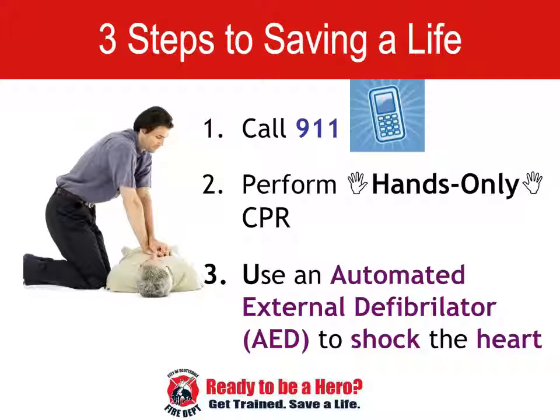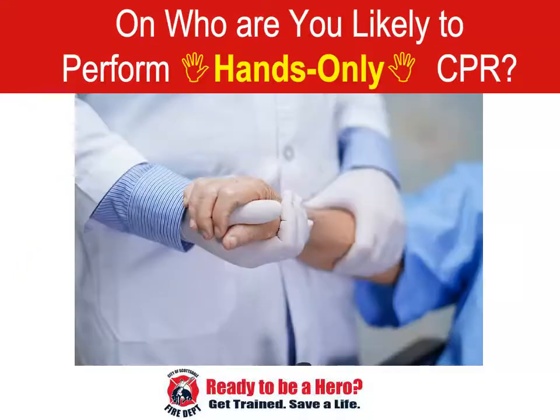If you can send someone to get an AED, that's great, use it. But if it is just you and the patient, don't run around trying to get an AED. It is more important that you start compressions. We must keep the brain alive, and moving the blood with compressions will help do that.